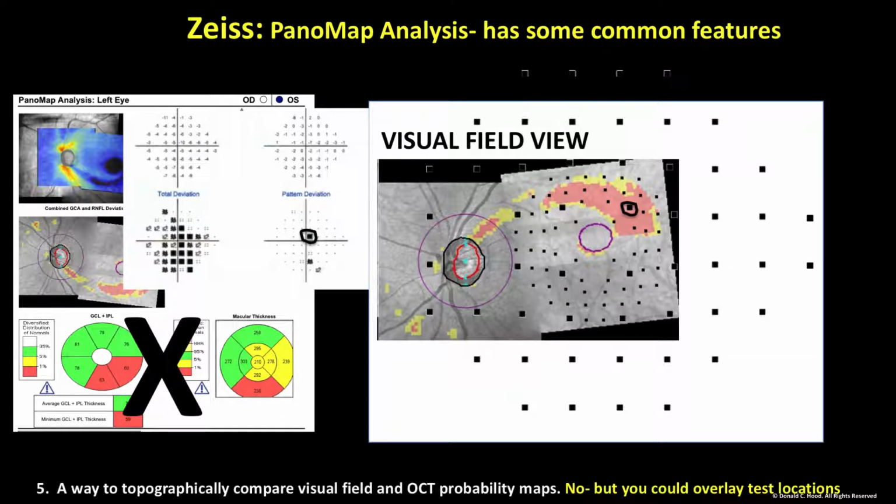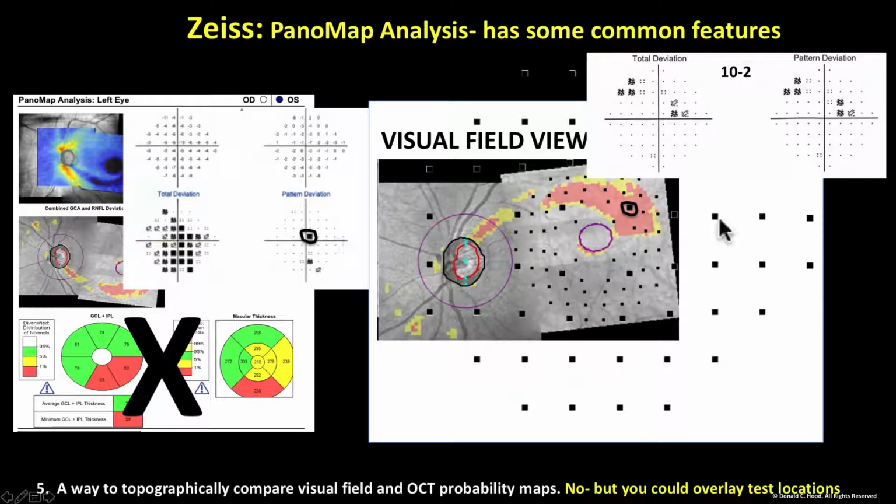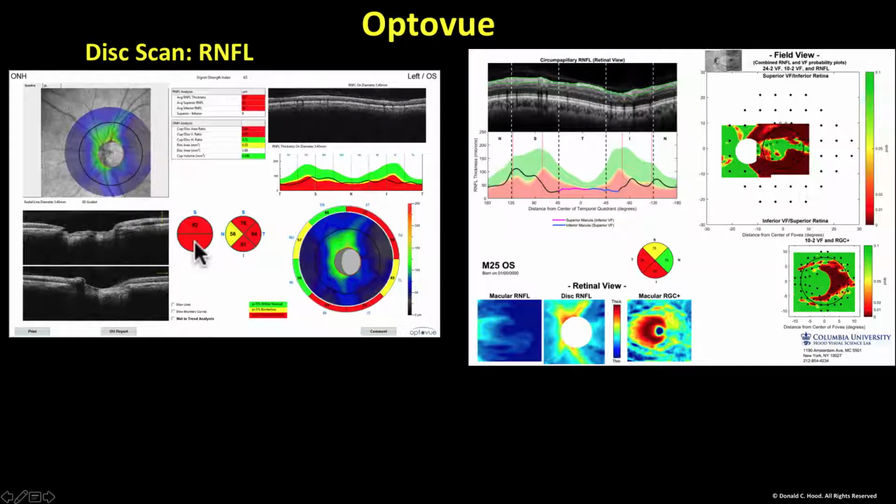That's that point there. To make my point, here's a 10-2. Let's circle those abnormal points, and that's what you get. So you can see the beautiful validation of this. You don't need to repeat the visual fields for this. You know what's happening in this patient based on this, although you may want to repeat the 24-2, in which case I suspect this would clean up.